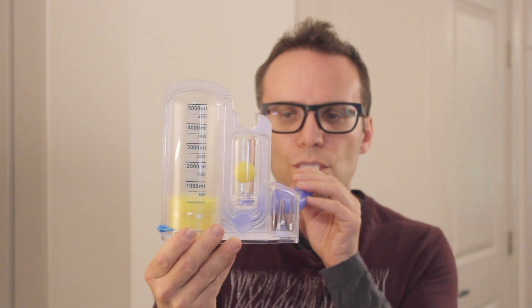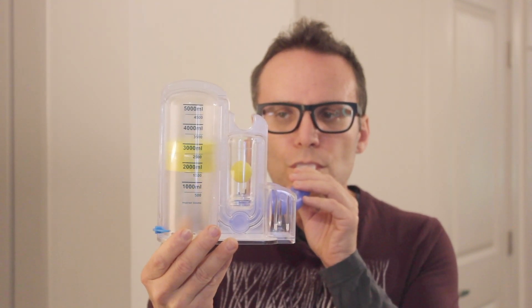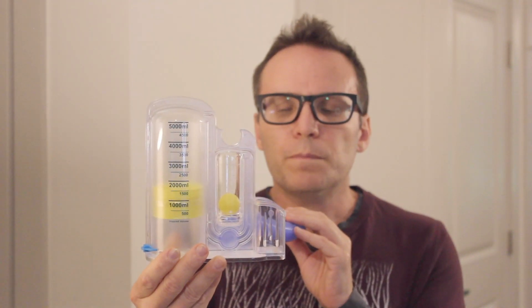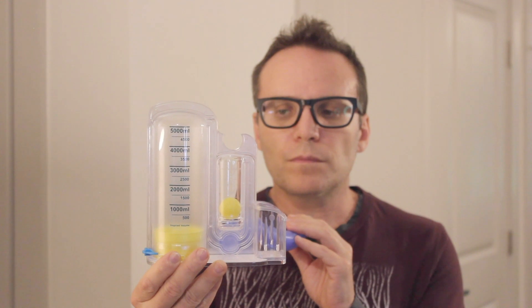Repeat this exercise ten times while trying to raise the piston up to the same level and monitoring the flow indicator ball. If you feel lightheaded, be sure to rest or slow down.